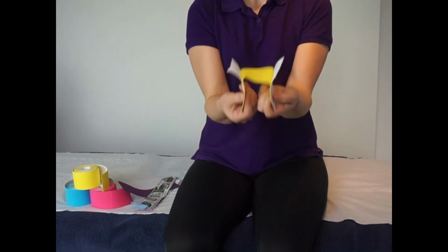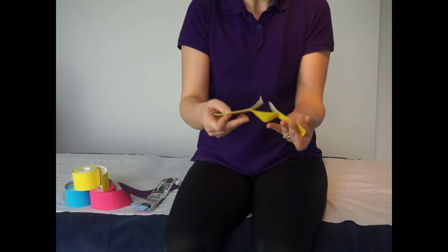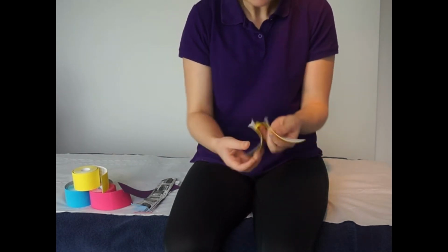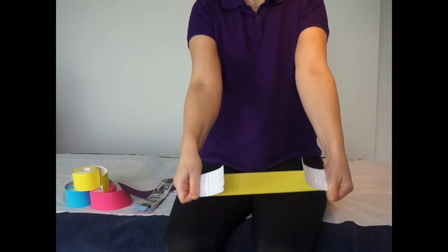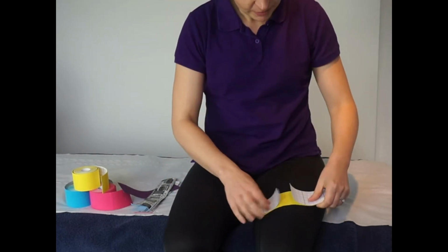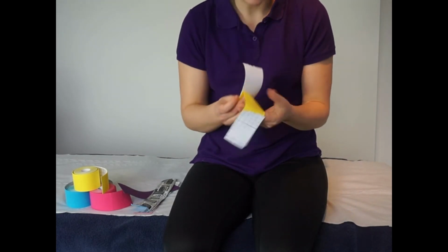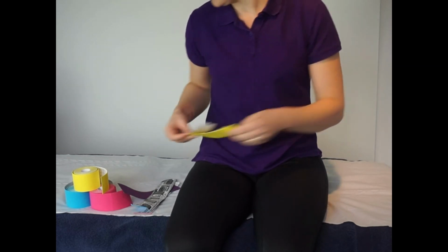Now first thing I've noticed is that the tissue and the paper has kind of come off the tape already. But if I try and fold that back on, there's a gap. And if I stretch it further, so I'm taking it to a heavy stretch, so coming up to 100%, actually just by that stretch the tape has come away completely from the paper, and if I stick that back together, again there's greater recoil, but actually it's just not very sticky. So this one just isn't as sticky as some of the other tapes that are out there.